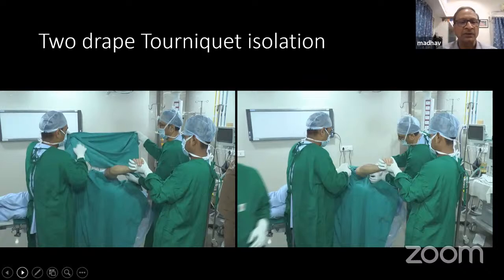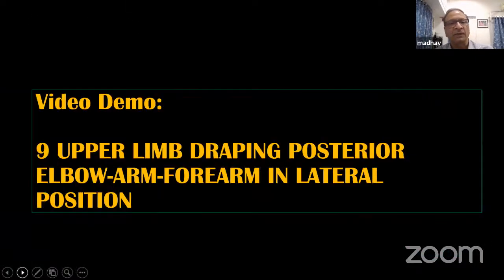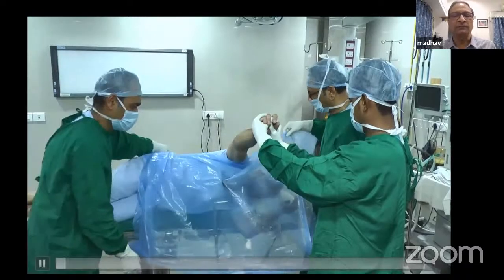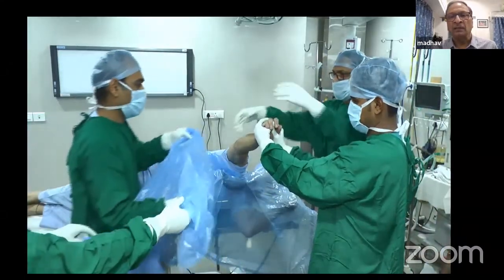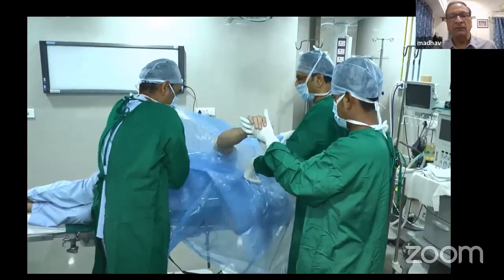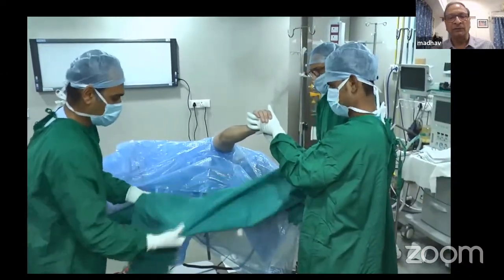So the anesthetized patient is on the lateral side with the limb to be operated held up. These are the various photographs of draping. Now we'll come to the video. So here the patient is lying. Again, the first thing that you do is isolate the part with a plastic sheet. The assistant is holding the scrubbed and prepared hand. This is the second plastic sheet which we have been constantly telling you about, through which the hand is threaded and it goes right up to the edge of the tourniquet.